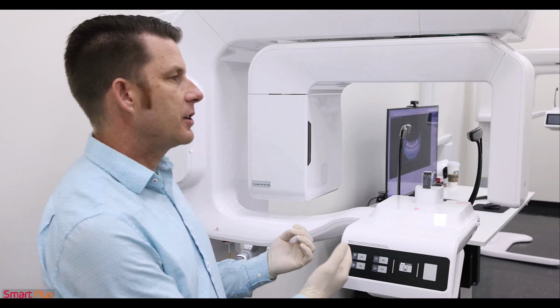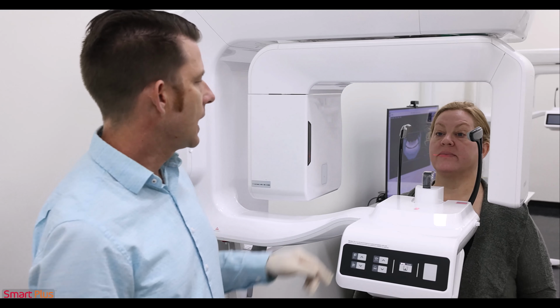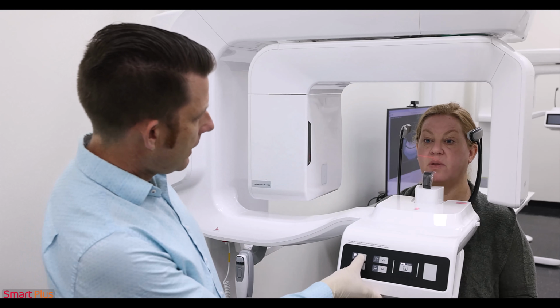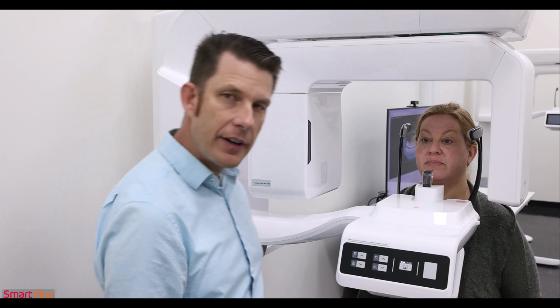First, I'm going to go ahead and bring my patient into the machine. Go ahead and stand up straight for me. And again, I'm going to get the chin rest just below her chin by moving the column up and down. And then I'm going to walk over here and we're going to do the same thing.